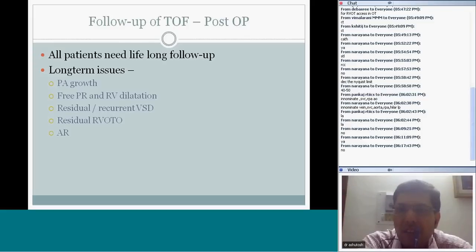Follow-up and echo is the arrhythmia. No, but this is the echo session. We are only discussing the echo in imaging echocardiology.